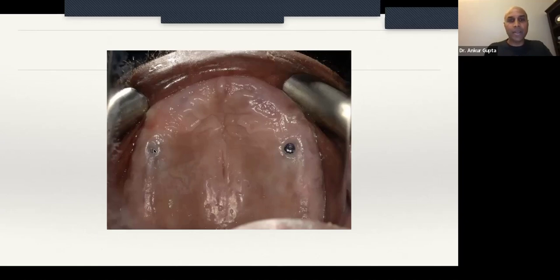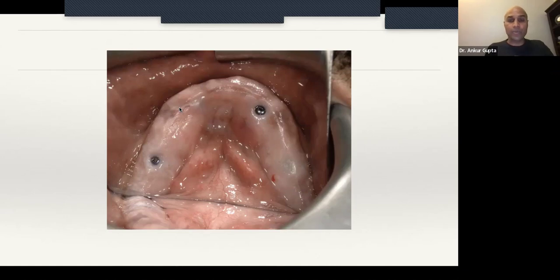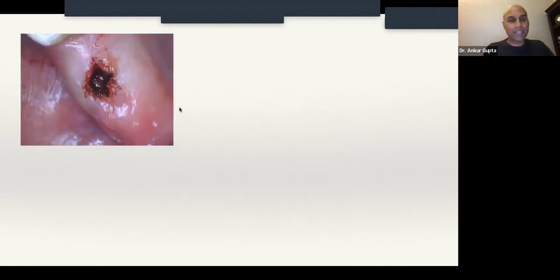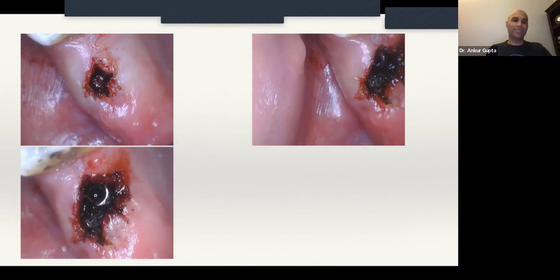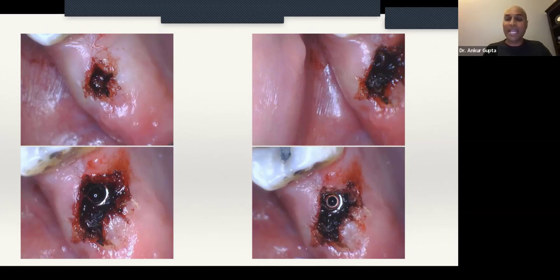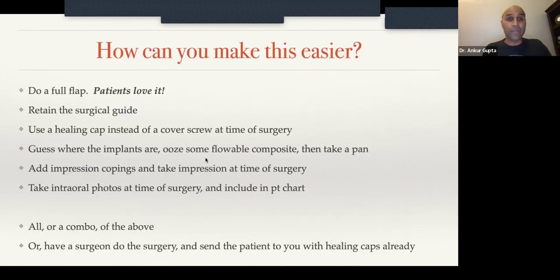In this case — the same patient's lowers — I'm using my diode laser and digging away at tissue to find an implant. I'm not feeling it. Maybe it's a little more buccal. I continue with the diode laser, and finally find it. After gouging a gigantic hole out of the patient, I found my stupid implant. That's not cool. The patient's going to be in pain and needs time to heal. You could also do a full flap, which is effective, but patients aren't going to be happy about having their whole mouth numbed and their gingiva jacked up.